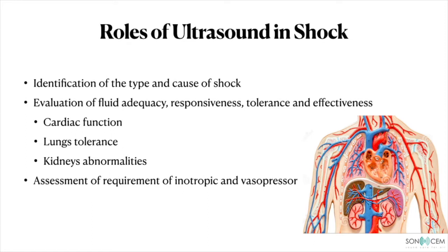We can look at the cardiac function, the state of the lungs, whether it is wet or dry, and the state of the kidneys, whether the patient has pre-existing kidney abnormalities or not. These can give us an idea of the patient's tolerance towards our fluid resuscitation. And apart from that, point-of-care ultrasound also helps us to assess the requirement of inotropes or vasopressors in the shock patient.